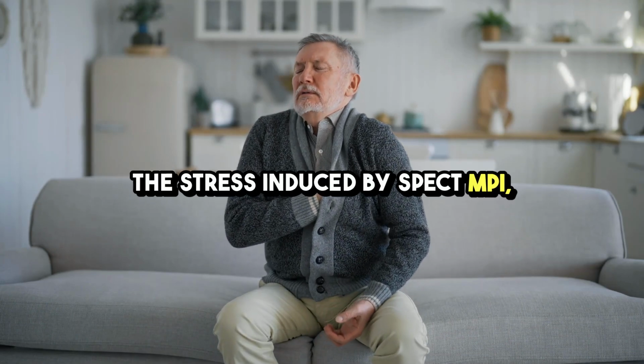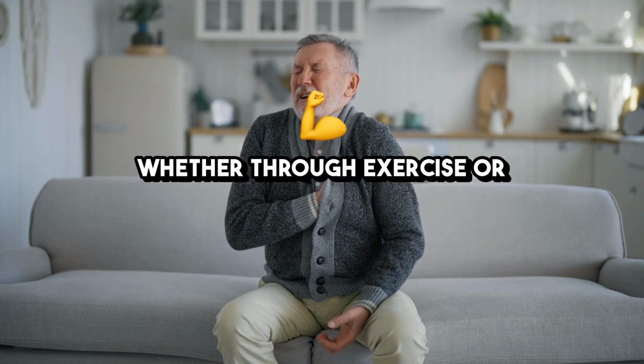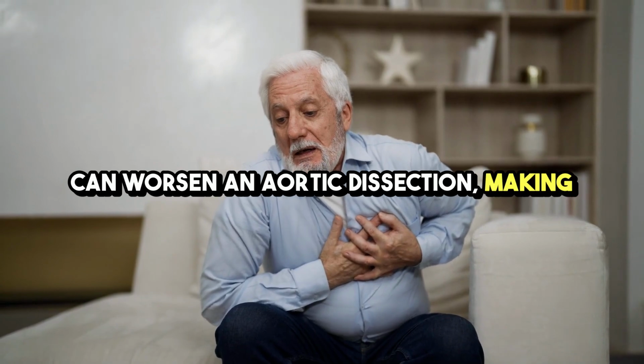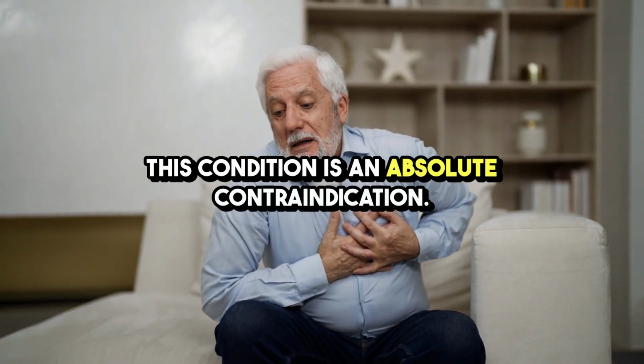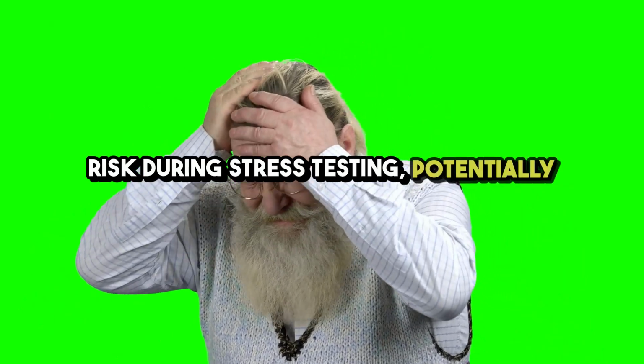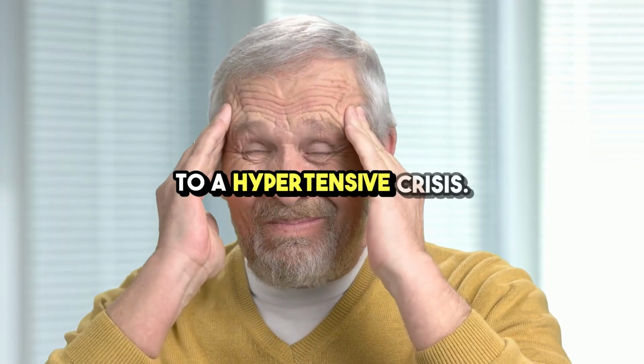cardiac event. The stress induced by SPECT MPI, whether through exercise or pharmacologic means, can worsen an aortic dissection, making this condition an absolute contraindication. Severe uncontrolled hypertension poses a significant risk during stress testing, potentially leading to a hypertensive crisis.